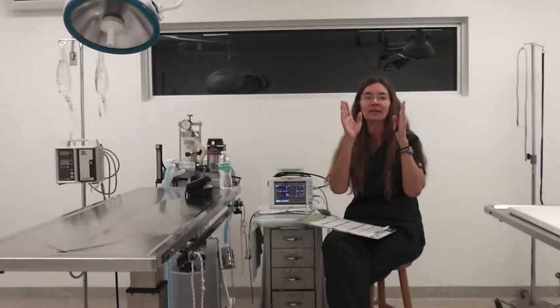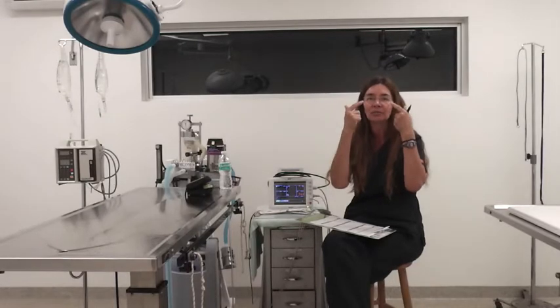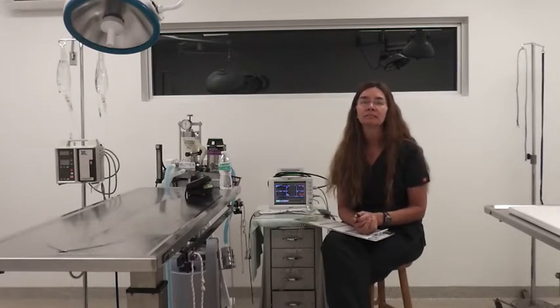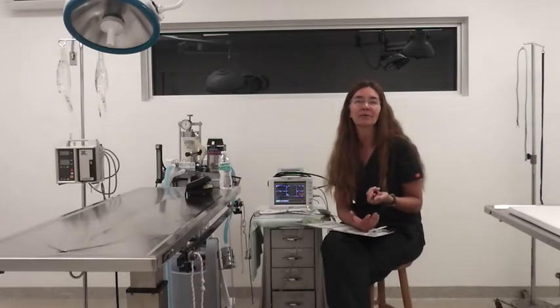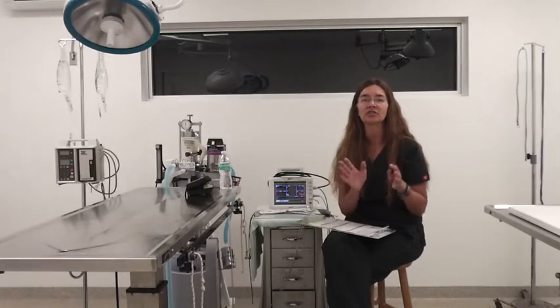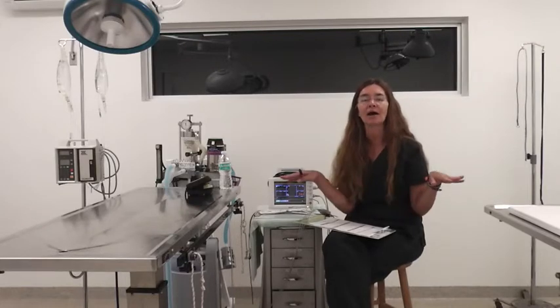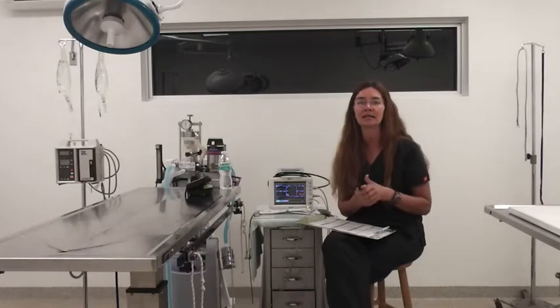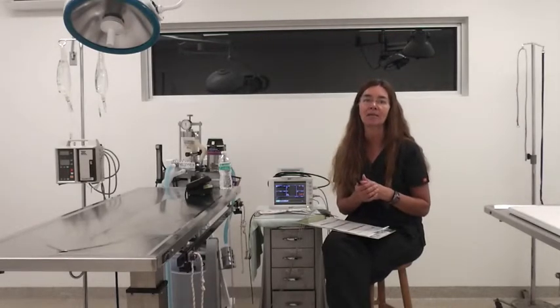As they start entering the medium and deeper anesthesia, their eyes will turn ventral medial, meaning that they'll go down, looking towards the chin area. Another reflex we can monitor is the respiration pattern. It will be irregular during lighter stages of anesthesia, and it will smooth out during deeper stages. So you'll start seeing them taking nice deep breaths.